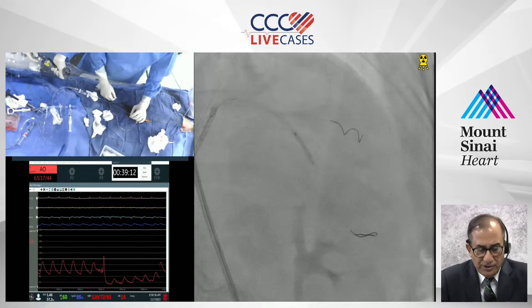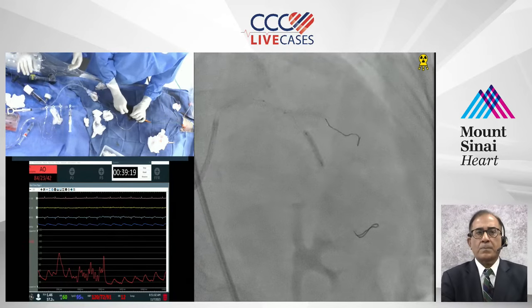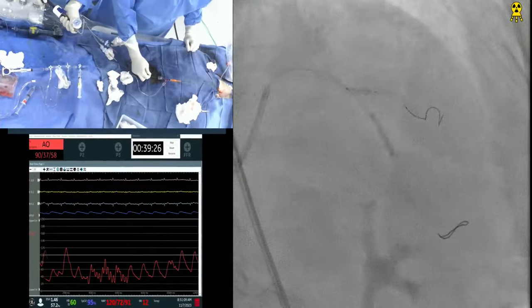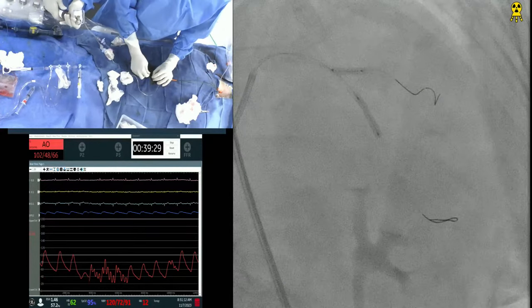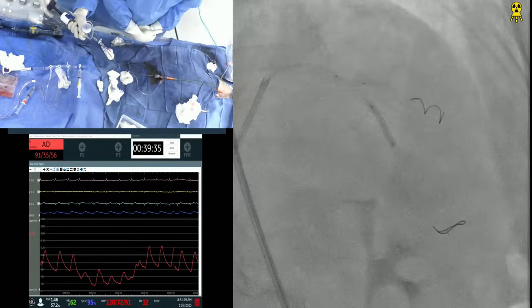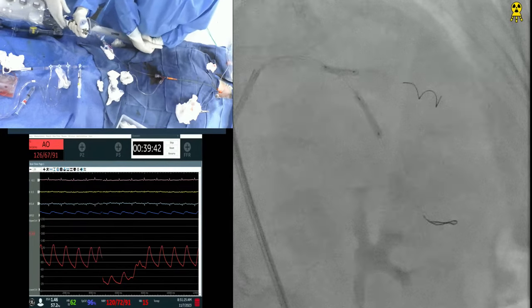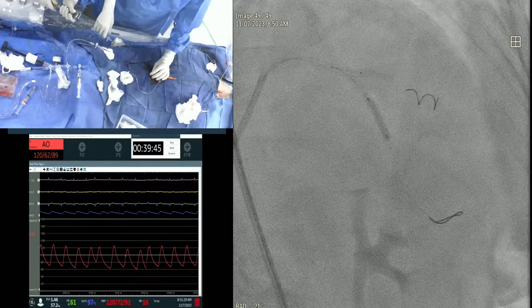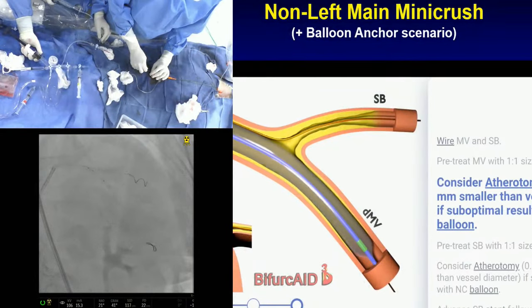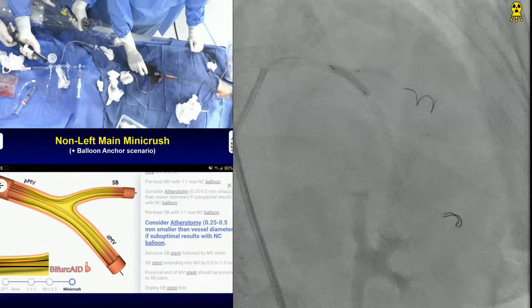Excellent observation and question, Hafiz. Very good point. We have published that we did not find any difference in the current stent generations, whichever one you use. Anecdotally, we have seen more side branch closure or more difficulty going into the side branch. Promus actually has been the best to get to the side branch. I always like the Promus stent as the best. But Promus will be gone now. They'll stop making the Promus. It will all be Synergy. Based on my experience, Synergy is not good, and our experience is also not good for the Synergy. You go 20, and I'm at 12 with the 3.0.